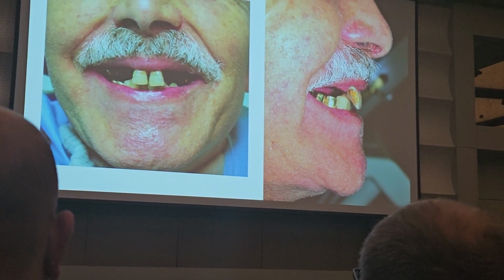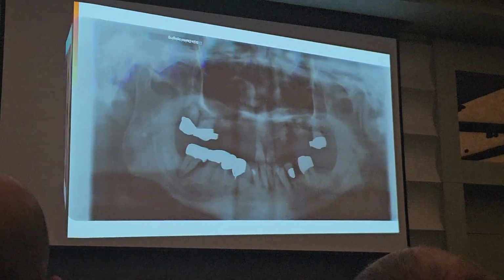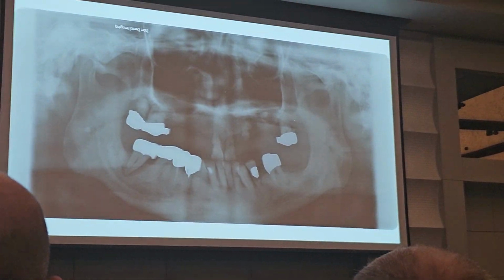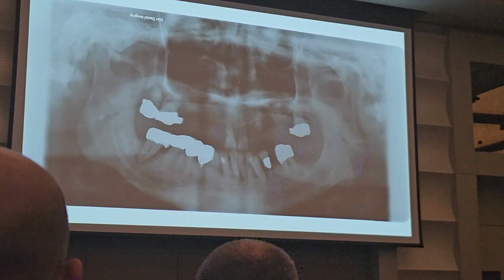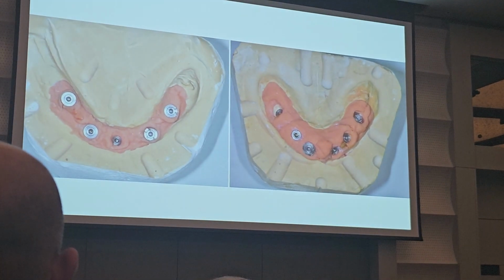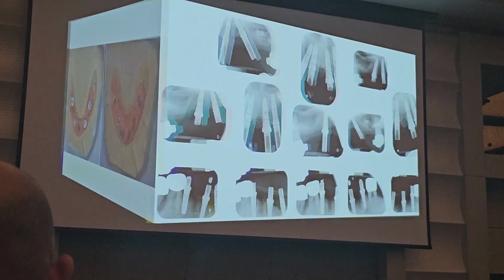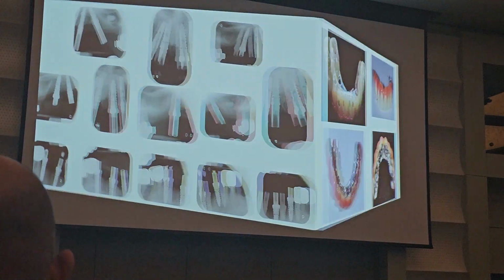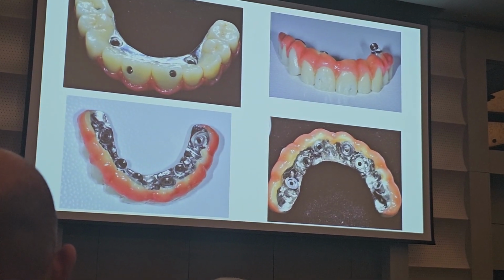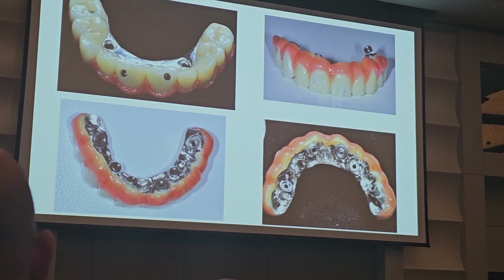And then we'll see with the technician what we can come up with. So, extract the teeth all day, place the implants in the same day, it was a circus. And this is what I ended up with. This is all the radiograph. Okay, this is the final process. I was dumb, and my technician was dumber.